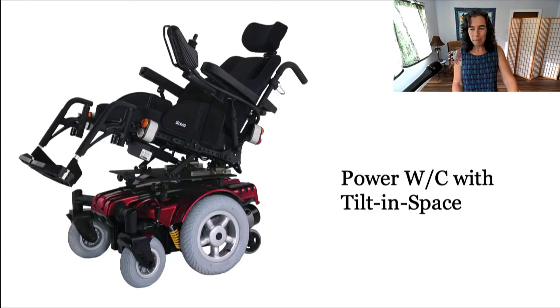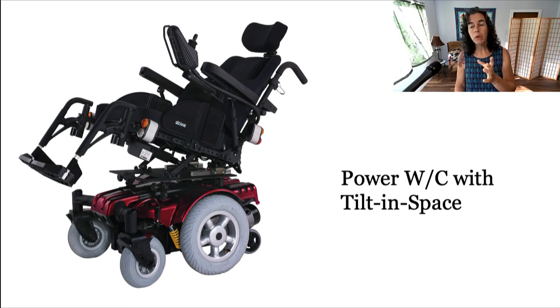So here is a power wheelchair with tilt in space. So we looked at one that was a manual tilt in space. This is a power tilt in space. It adds cost to the wheelchair, but it also enables it to be much more customizable and to better fit the need of the individual. Now, remember, if someone's using a powered chair, chances are, not always, but chances are they have less mobility. So this option of the whole chair shifting in space or tilting in space could be great because rather than the person needing to leave the chair to get pressure relief or a change in position, we can simply tip the chair or tilt the chair.